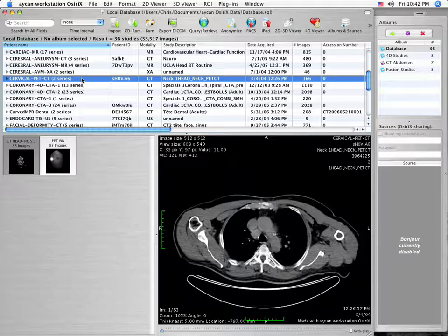PET and CT series, as well as MR and MRA series, can be fused with the Aiken Workstation Osirix Pro application.